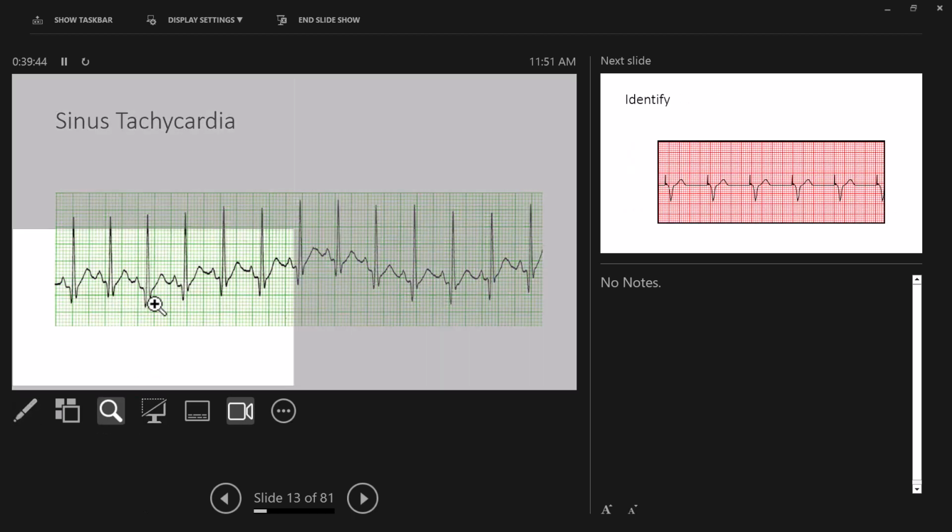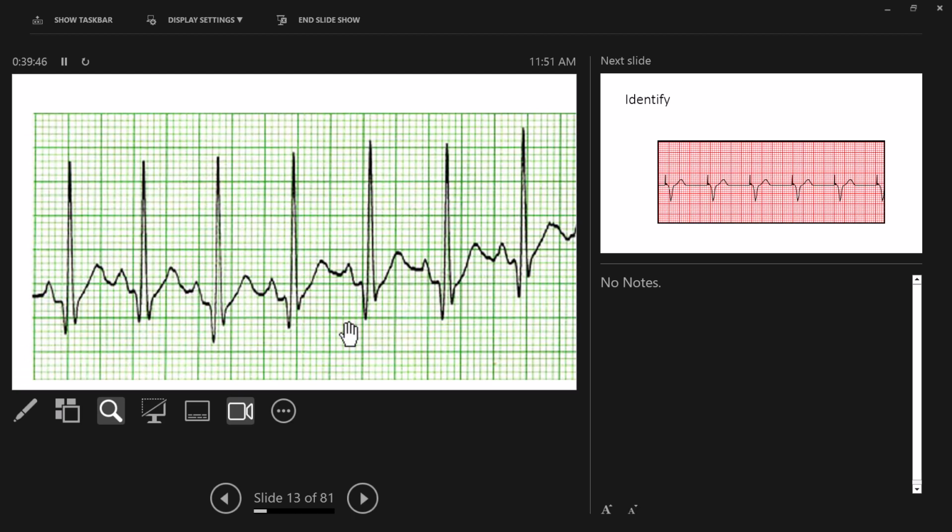You see the difference that we can see here with sinus tach? Remember, this rate is 130. The one that we had earlier was 190. With 130, we're able to pretty easily see the P waves that are in there. Now, for whatever reason, this converts over into SVT. Did I say VTAC? I didn't mean VTAC. SVT.